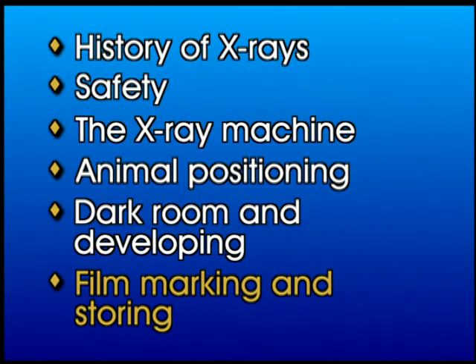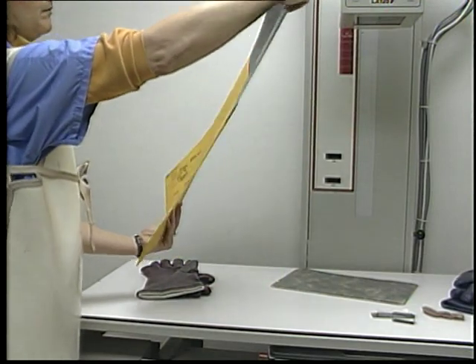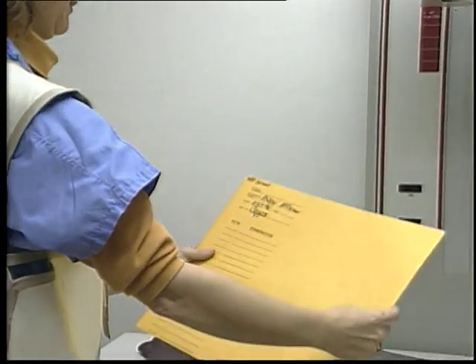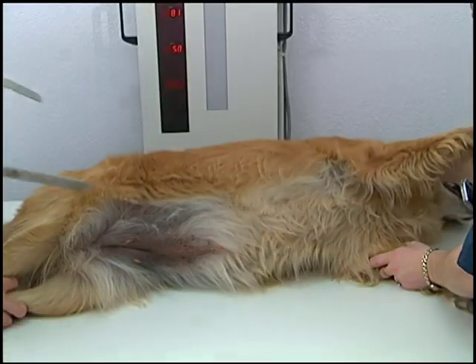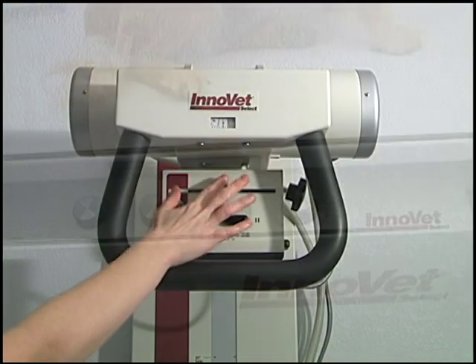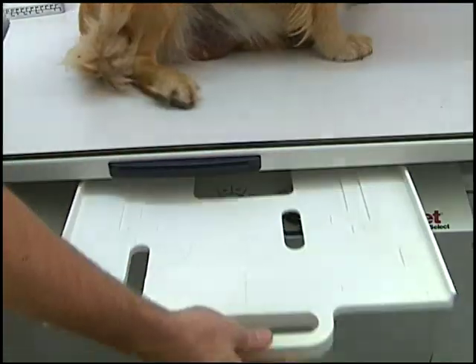Proper storage of X-ray films involves storing them in properly labeled paper sleeves. They can then be filed by the owner's last name, an assigned ID number, or by the date they were taken. The fascinating world of radiology can be a very safe and rewarding experience if you act upon the fundamentals you've learned in this program.